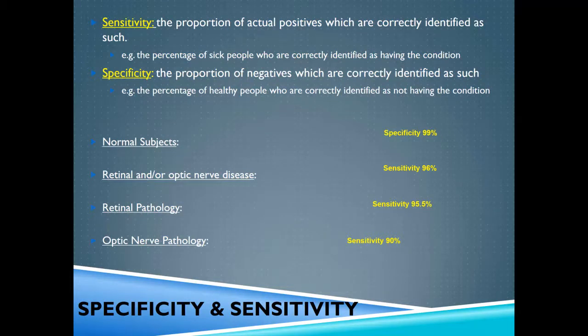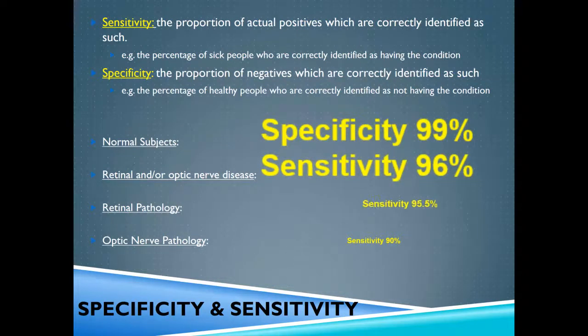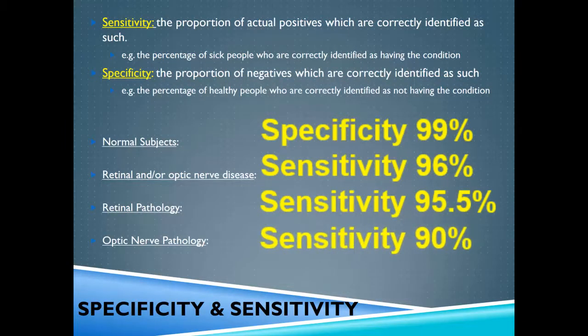If you're using one of these systems like the eye scan, if you will, you can do it in about 2 minutes, and you can run everybody in your practice with great success. You can also take ultra-wide field images of everybody with Optos, which also makes sense. And I know some clinicians that actually do both in everybody, and they have very successful practices. Some young doctors' practices are growing by leaps and bounds because they're providing a very high level of care.